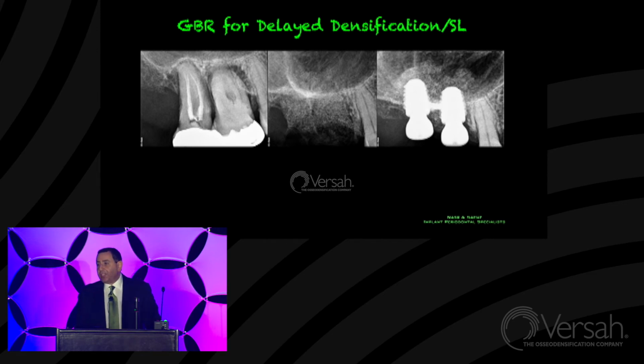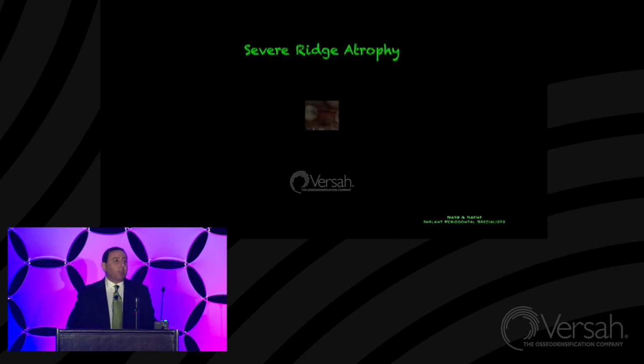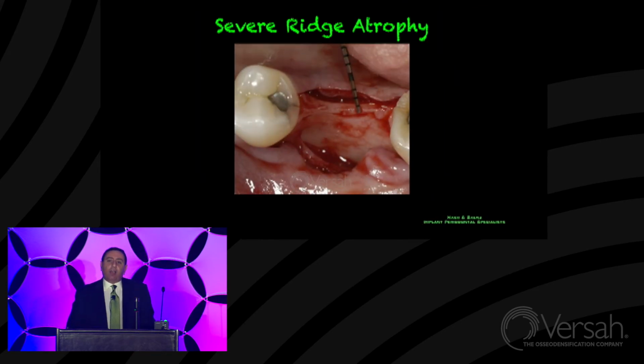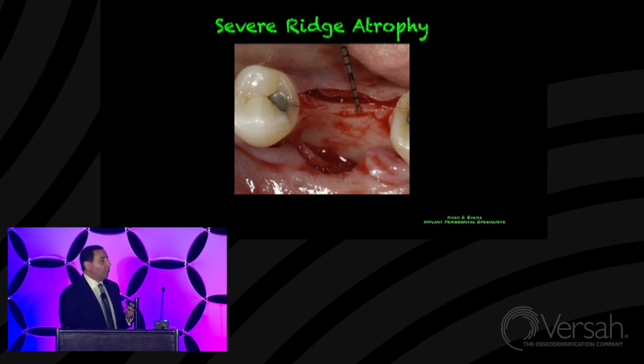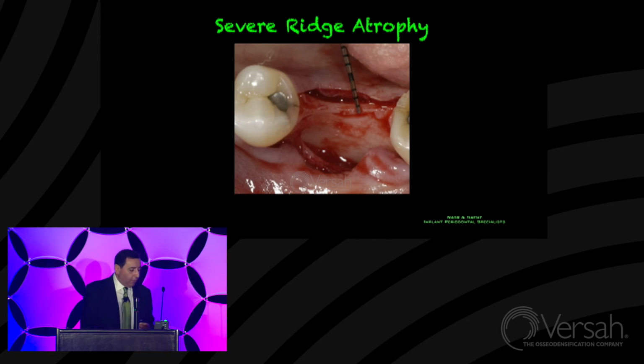Sometimes I like to push the envelope to see how far I can go with the system, and I haven't been using the Versah drill system for more than about 13 or 14 months. This case came by, and I told the patient, you know, your ridge is really thin. I have a technique that I will try, and if it doesn't work, don't pay me until it works. So if it doesn't work, you have nothing to lose. So I looked at this ridge, and this is a 1.5 millimeter ridge. 1.5 millimeter ridge is really pushing the envelope too much, but I said, let's see how far we can go with this. So we use our piezo microsaw, and I like that particular size.